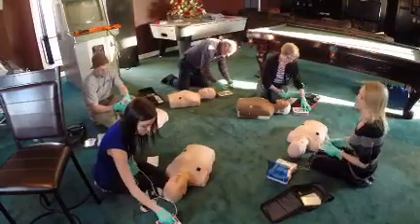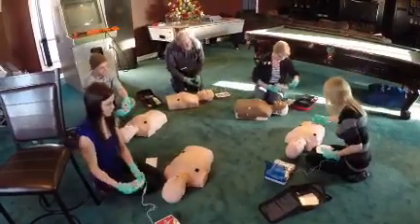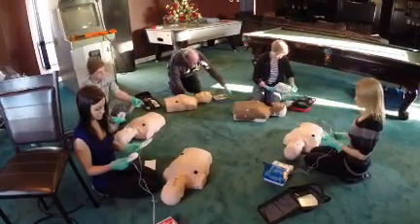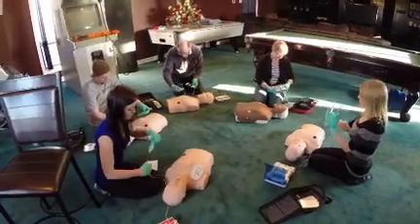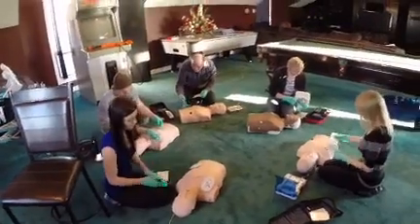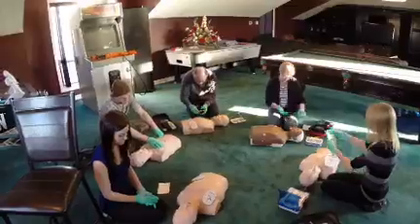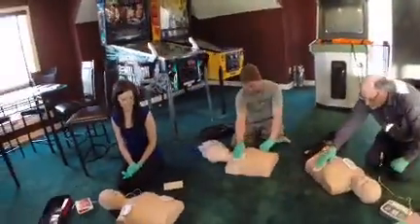Remove clothing from the patient's chest. So removing the clothing, we're going to take those scissors, open the shirt, bare skin, shirt off. Apply pad as shown in the picture. Now look at your pictures, and apply your pads. Apply pad on the patient's bare skin. One goes on the top, and the other one goes on the patient's side.